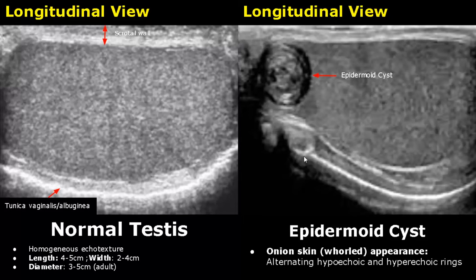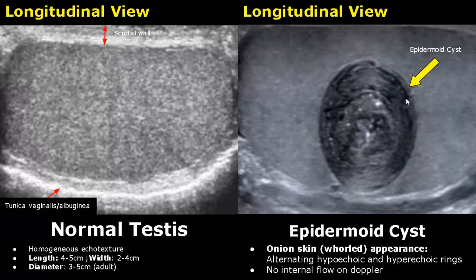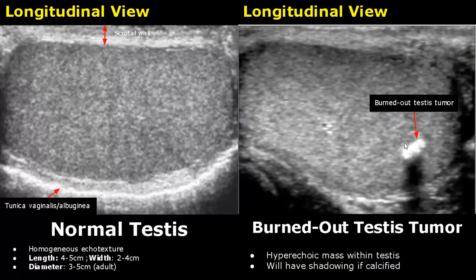An epidermoid cyst is a rare benign tumor. It has an onion skin or whorled appearance consisting of alternating hypoechoic and hyperechoic rings, and will not have any internal flow on Doppler. A burned-out testis tumor appears as a hyperechoic mass within the testis — usually it is calcified and has posterior acoustic shadowing. It is malignant.